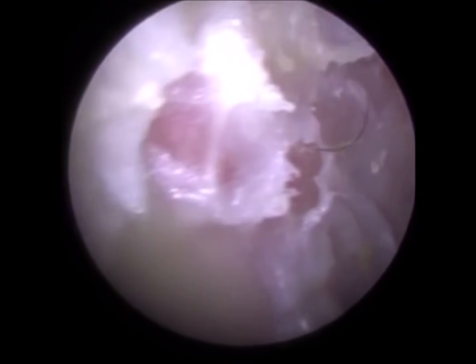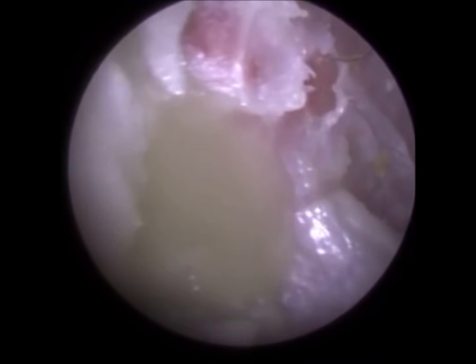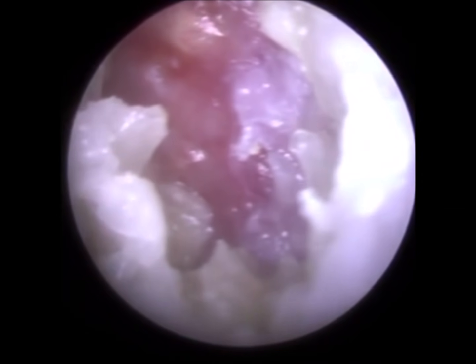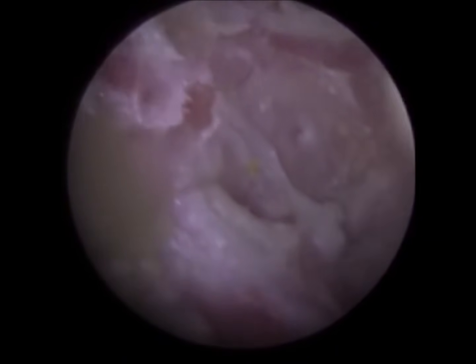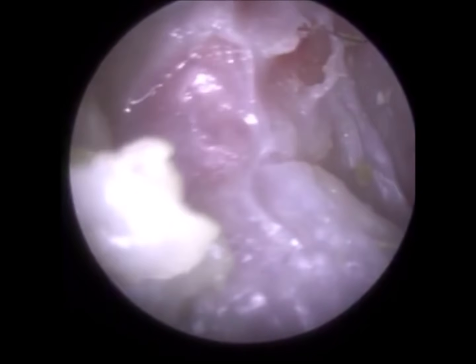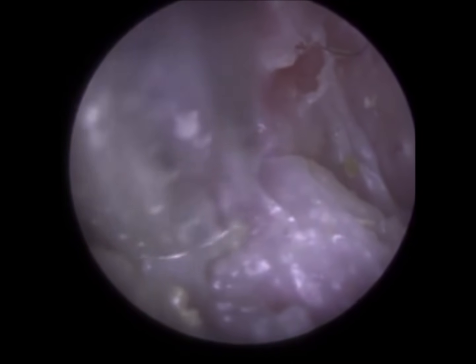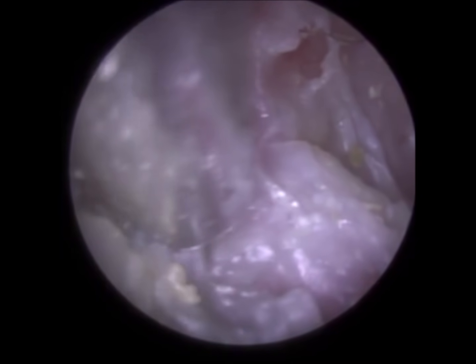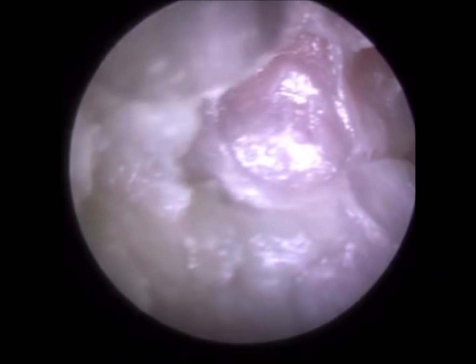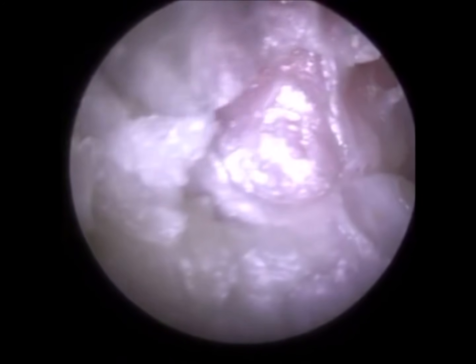And he's also got a third one which will come in view. So the third one is there where this dampness is. So that's crater 2 to the left, crater 1 to the right. Still a bit more keratin there, and you can see where that dampness is here. There's another crater there. And this is definitely his mastoid bone. So his mastoid bone is most certainly infected with mastoiditis, and it's beginning to erode. And I suspect he's going to have surgery to remove some more of this bone, because it must be diseased.